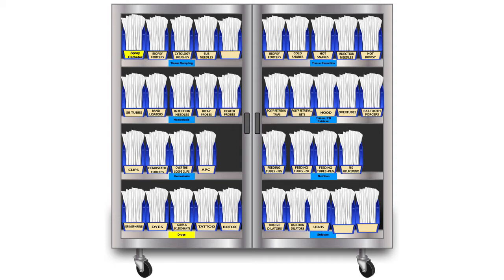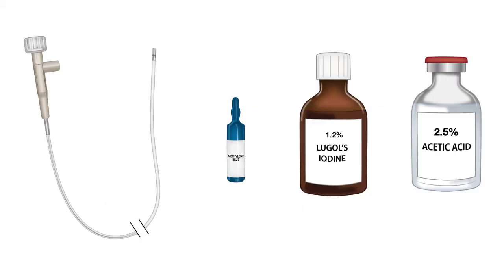Let us review what you need. We need a spray catheter, and sometimes you can do the spraying in the colon using the water jet as well, by putting the material into the water canister. So either the spray catheter or the water jet.